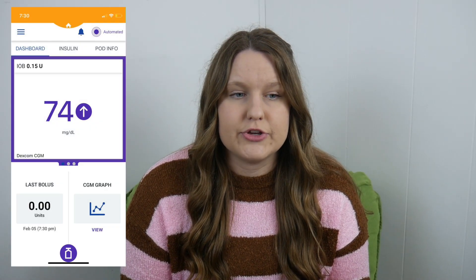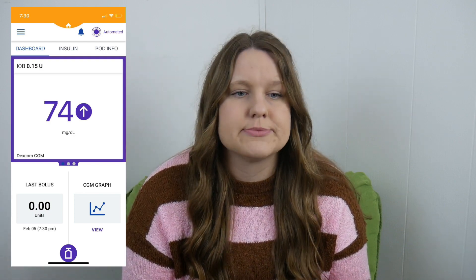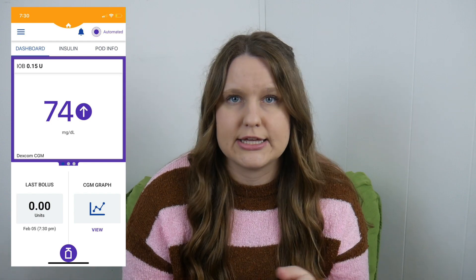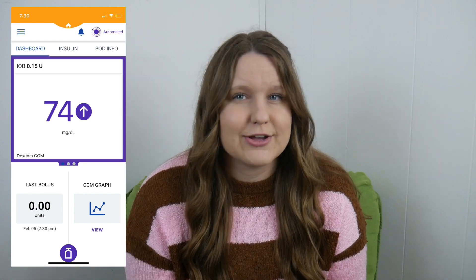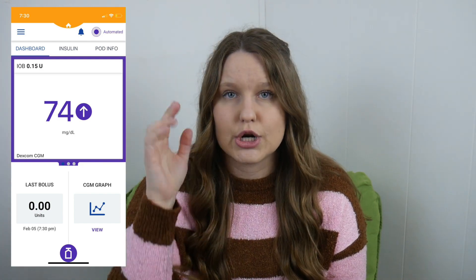I like that it's very obvious on your main screen whether you're in automated or manual mode — it's in the top right-hand corner in plain English. I also like that on the main screen you can see your Dexcom value, the trend arrow, and your insulin on board — all very accessible.